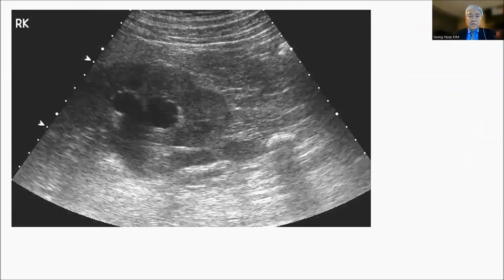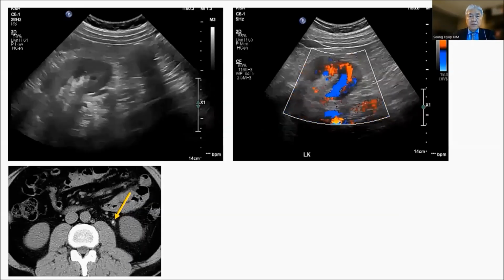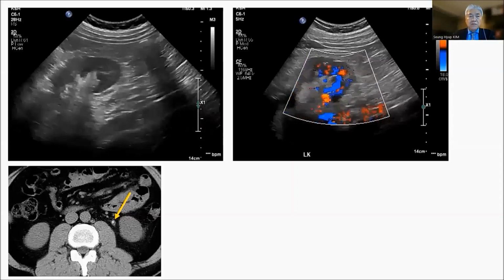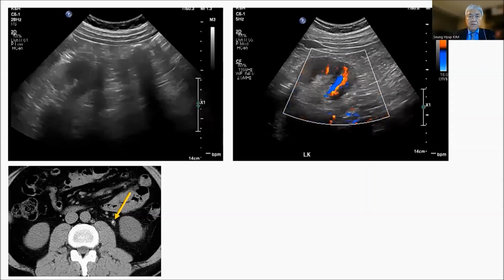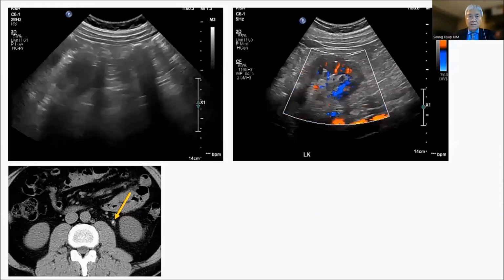You may trace proximal ureter from the dilated renal pelvis, and you may detect the cause of hydronephrosis, ureter stone in this case. It may be difficult to trace the ureter if the ureter is not dilated enough, but if we put more efforts, often we may trace a less dilated ureter, like this case.